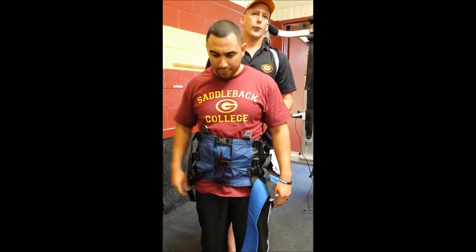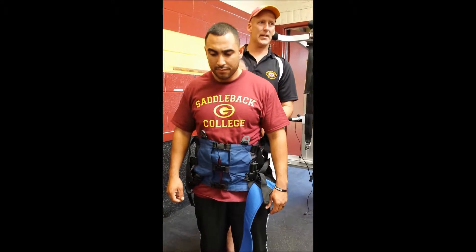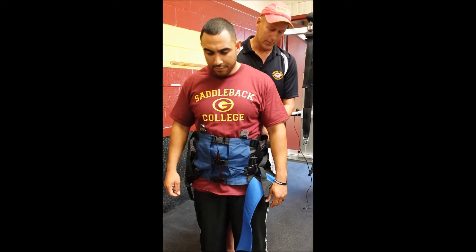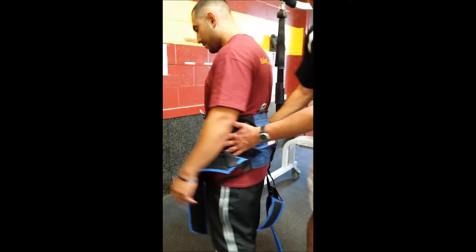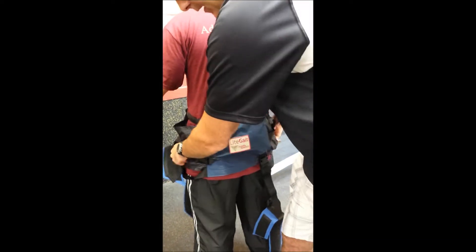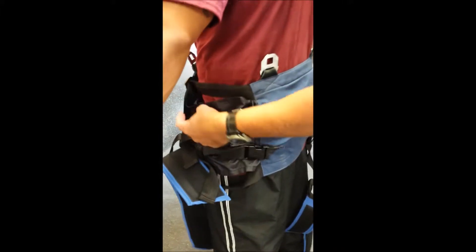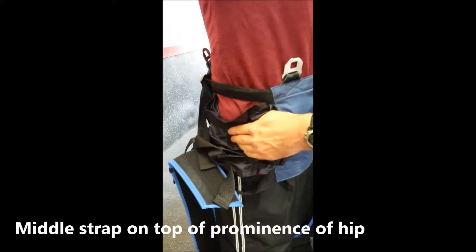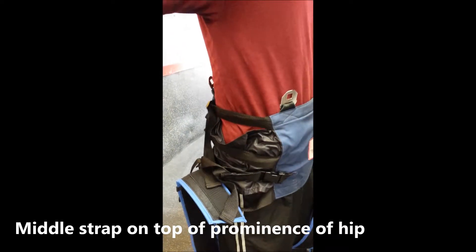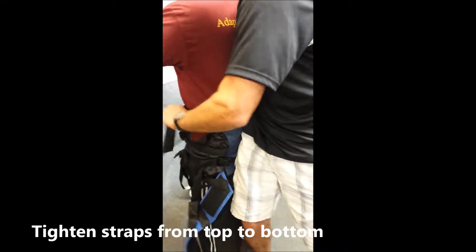It takes about three or four sessions before someone gets really comfortable, even with me setting them up. The next thing I'm going to do is come back around the backside and keep this pretty snug. The middle strap here is going to be right around Tim's greater trochanter — the bony prominence around the hip. I'm going to put my hip right here and tighten from the top down.